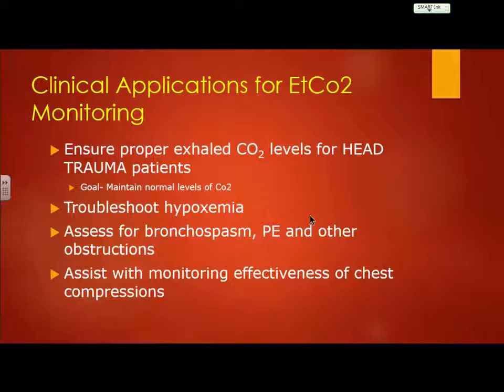And again, I like to reinforce that, even with cardiac monitoring. You treat your patient, right? You treat the monitor too. All right, so that's not 100% accurate, treat the patient, not the monitor, because your monitor tells you a lot. But you've got to have your clinical assessment, your clinical application to what you see here, and if you can correlate the two together, then yeah, if I've got that patient with a history of asthma and all that, and then I see a rapid rate with that shark fin, there you go. You know what I mean? But then sometimes you may have this patient that's just in respiratory distress, and you really can't get to the bottom of it. Because not all the time are you going to just get these very prevalent and apparent wheezing sounds. But then on the flip side of that, not everything that wheezes is asthma, right?